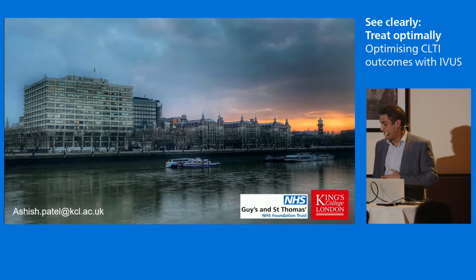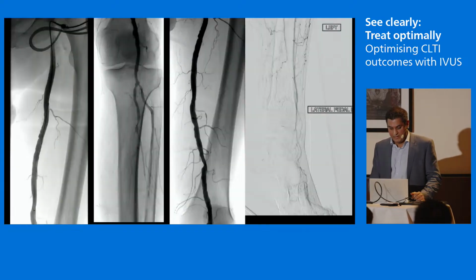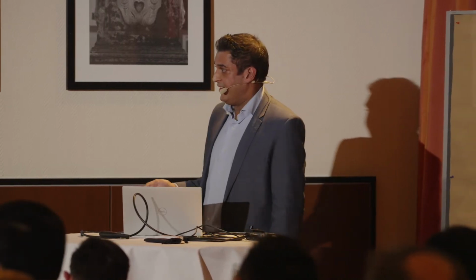Sorry, I can't show you the actual angiograms, but let's keep going. It keeps doing this, which is very irritating. So you may have noticed she had some iliac inflow disease on her CT. So on the way out, we just treated the iliac artery.